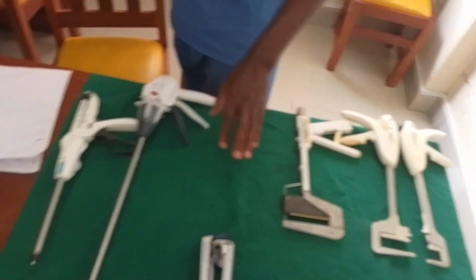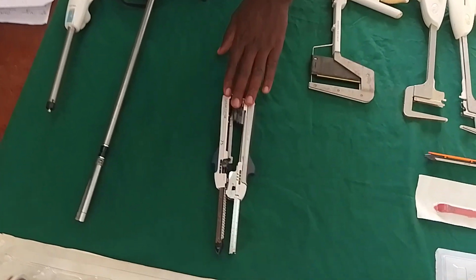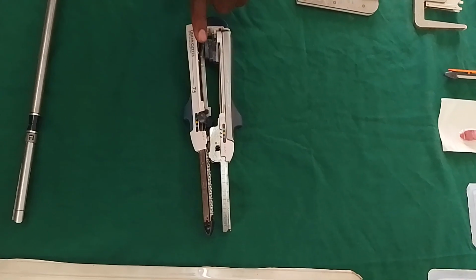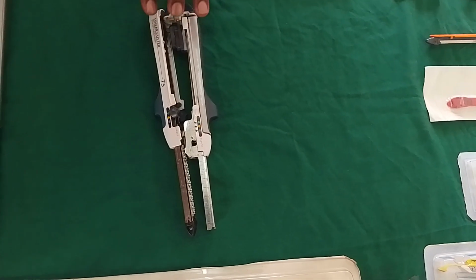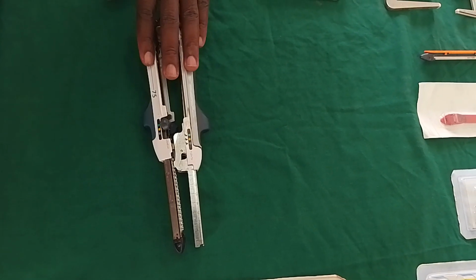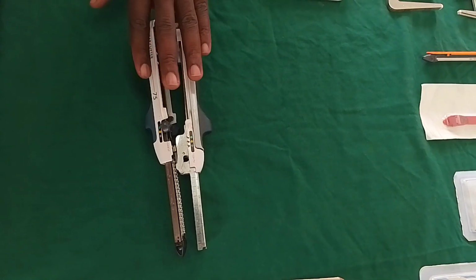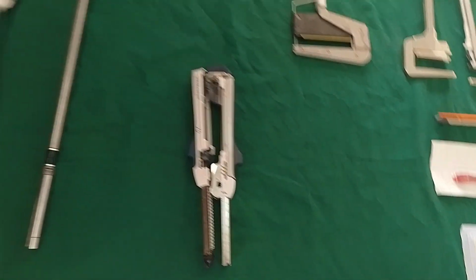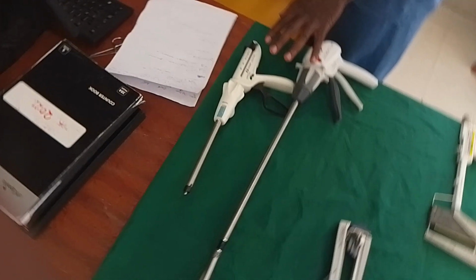We also have linear staples. Linear staples are also used. These are GIA. GIA, I told you, it means gastrointestinal anastomosis. So we use them when we are doing gastrointestinal anastomosis. Here we have endo-GIA.